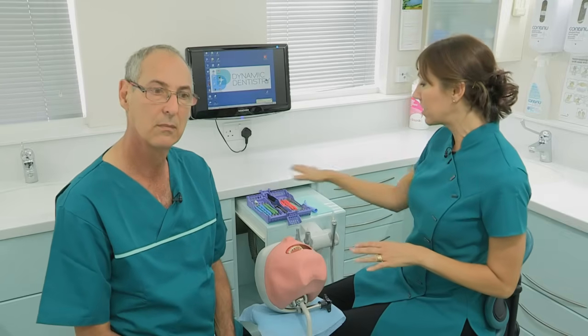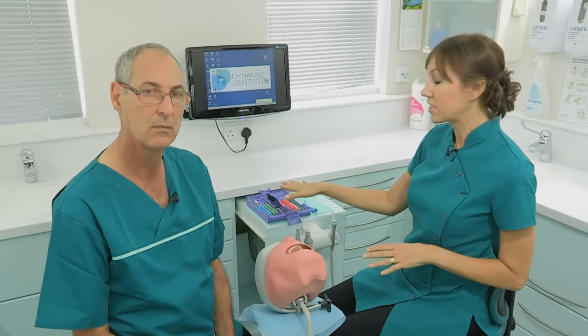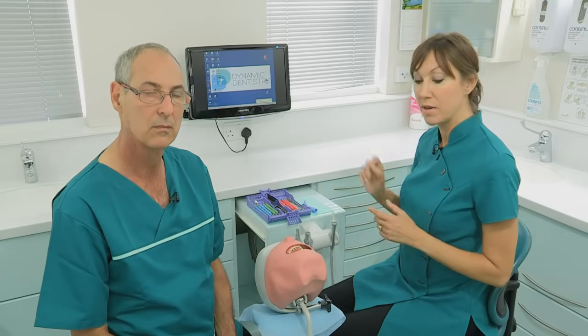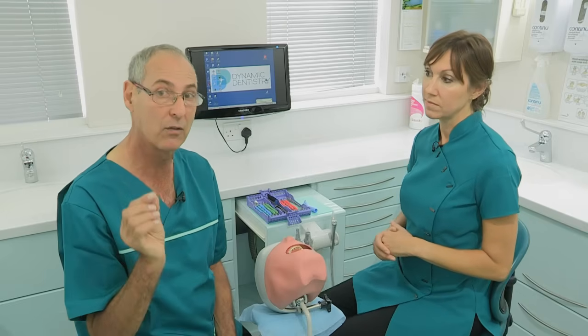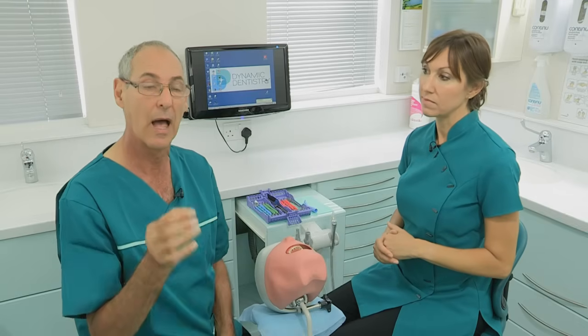So we need to look at the surgery design where the instruments can be placed so that she can pick them up, use them, pass them to the dentist and return them to the tray without having to move her posture. Not everybody's going to be able to do this and redesign a surgery immediately, so you have to think out of the box and maybe use a drawer to put the tray in or a Mayo trolley just behind the patient's head. So you have to compromise a little bit. In a brand new surgery, this is what we'd go for.